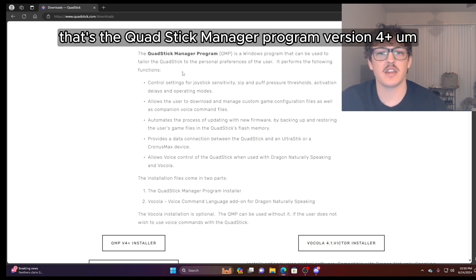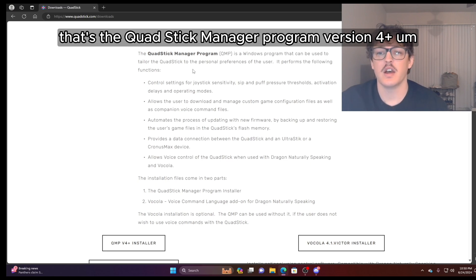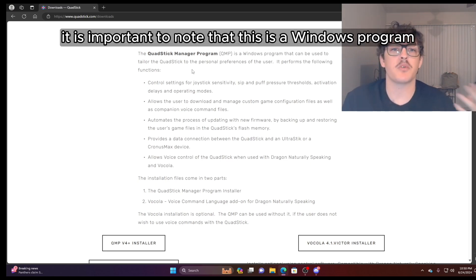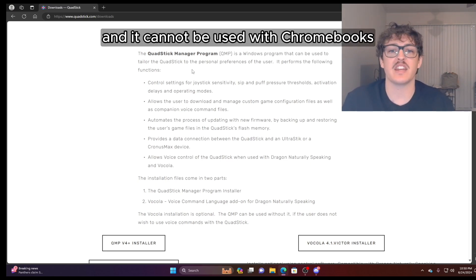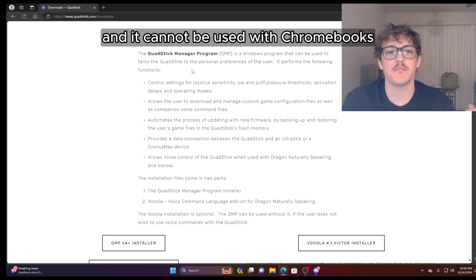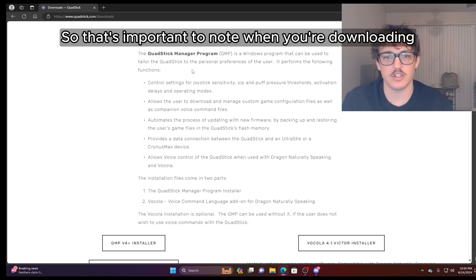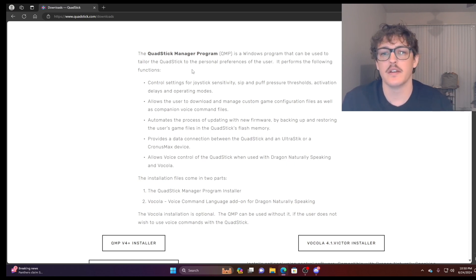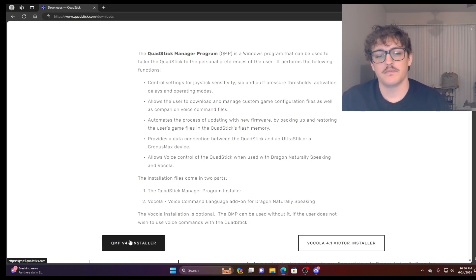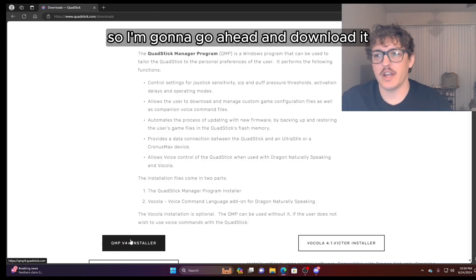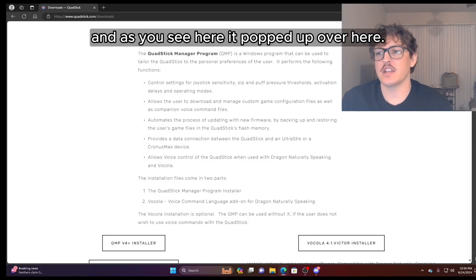It is important to note that this is a Windows program and it cannot be used with Chromebooks, MacBooks, and it strictly works on Windows machines. So that's important to note when you're downloading the software. So I'm going to go ahead and download it.